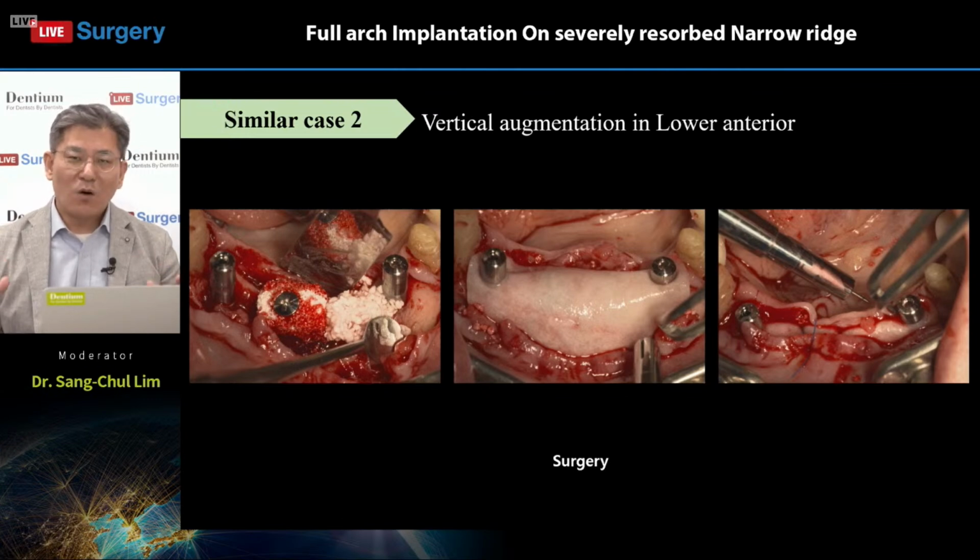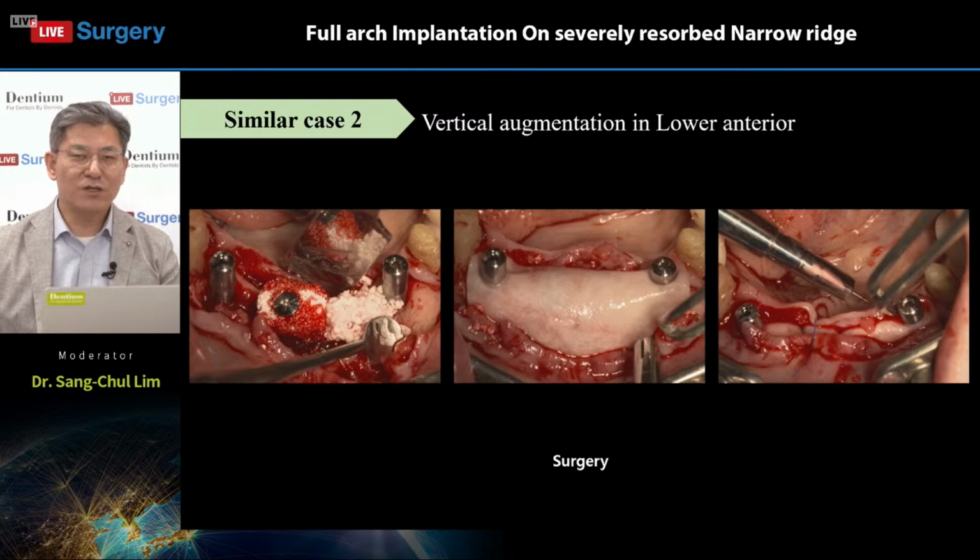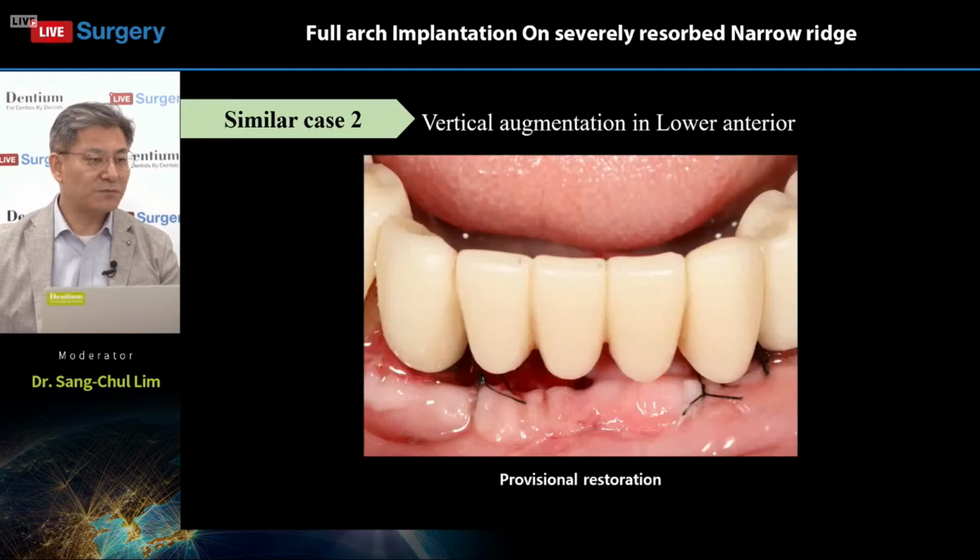So the whole thing, all the structures, the new bone, bone graft materials and soft tissue structures, are integrated and intermingled, healed as one unit. These procedures offer a lot of advantages for the surgeon and patient. So nowadays the transmucosal GBR procedure has prevailed compared to the traditional style.